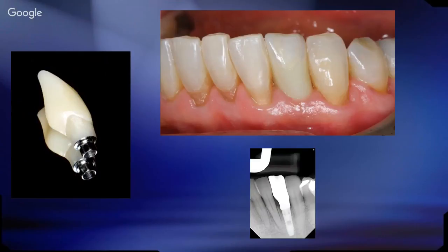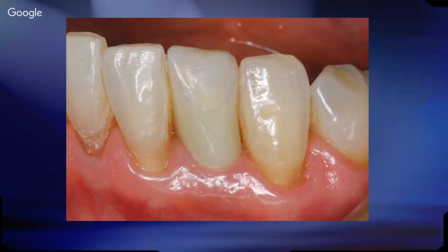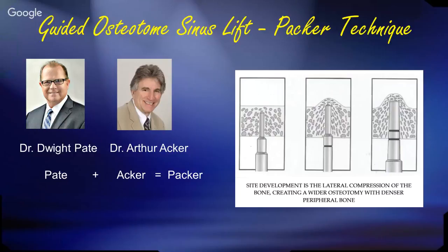Now, interestingly here, we did do a screw retained restoration. Even though it was a 2-piece, I was concerned about getting cement down below the tissue. So for this particular patient, we actually drilled a hole through the crown and used composite to seal the access on the facial. And the patient was actually quite happy with it. As a matter of fact, here's a 2-year post-op. This picture was actually taken today. Patient was in for her recall today, and we took this picture, and there's the composite. Doesn't bother her. She's happy. She doesn't even know the difference. So that's one case, doing an immediate placement.